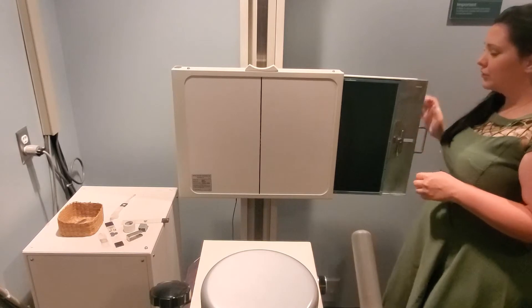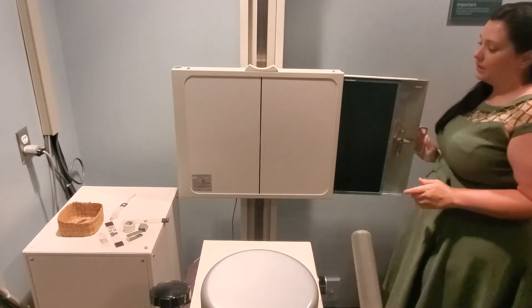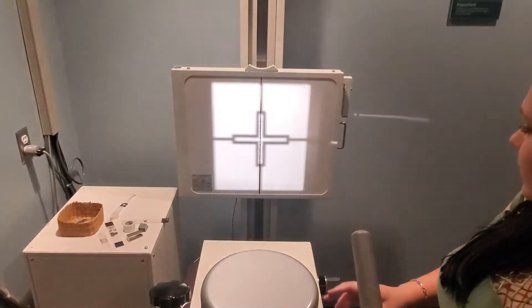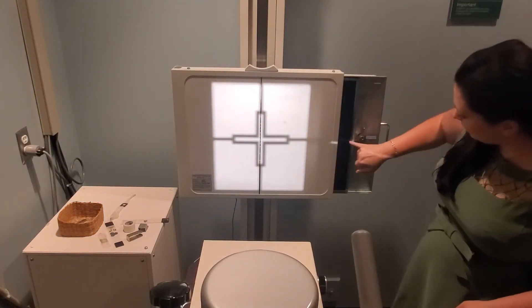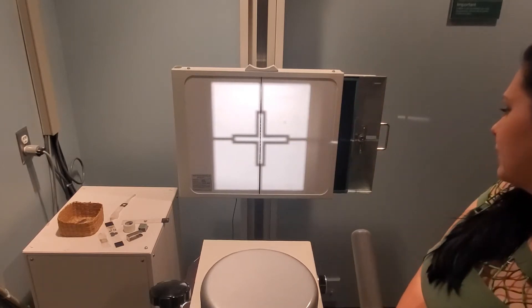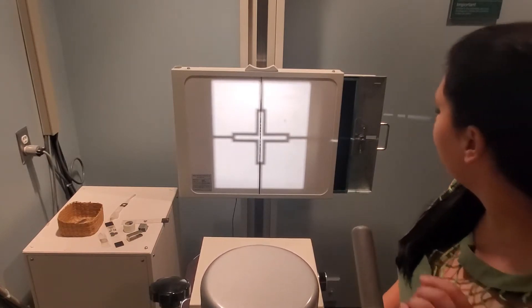For this projection, you're going to use a 14 by 17 cassette lengthwise. Touch the tube, touch the bucky — make sure you align your light field so that the collimator head and the cassette are aligned with one another, so that you're actually getting a picture of what you intend to take a picture of.